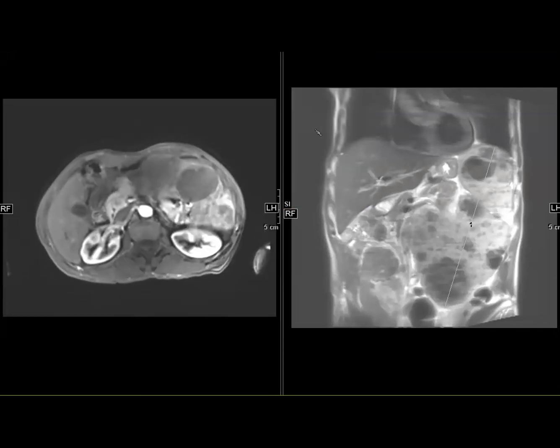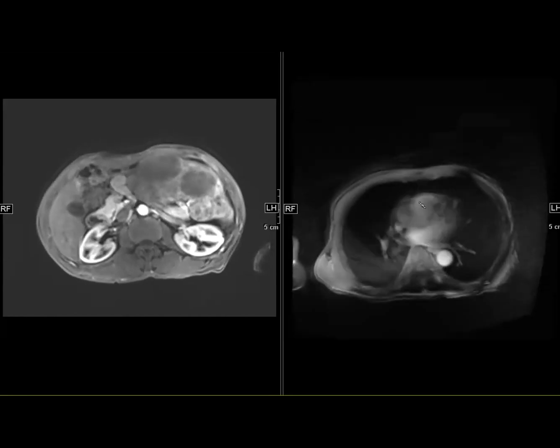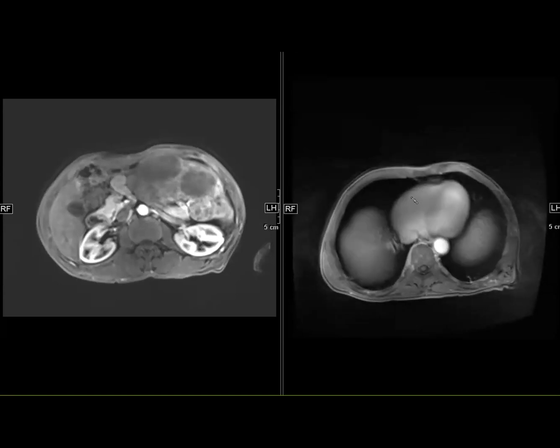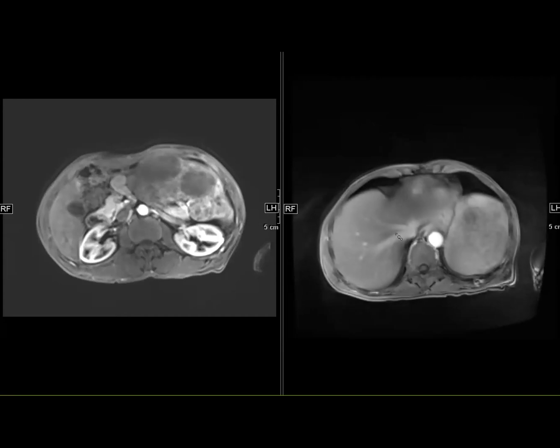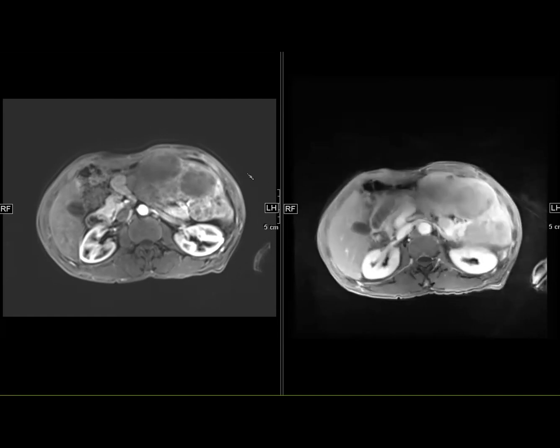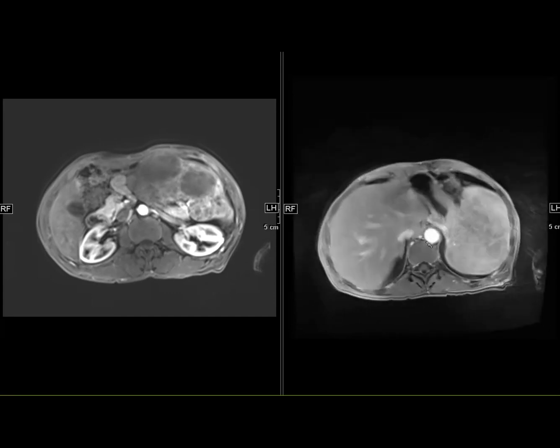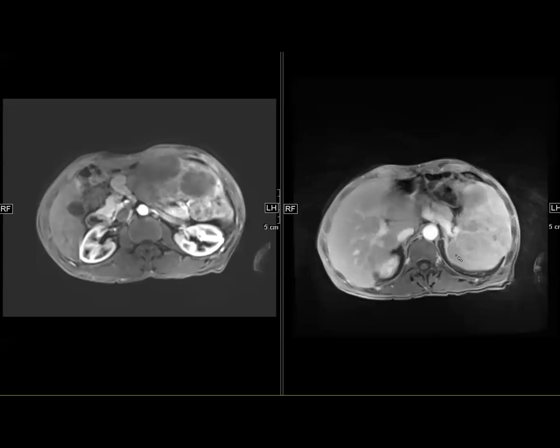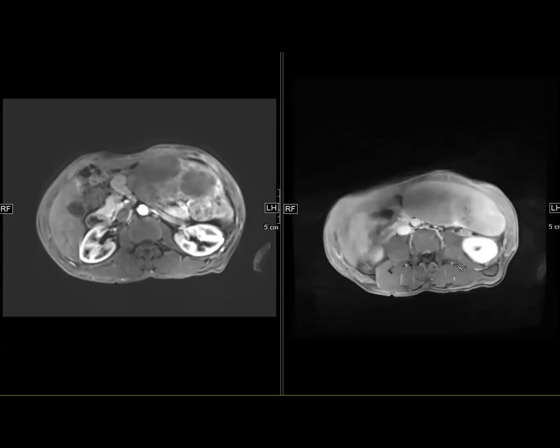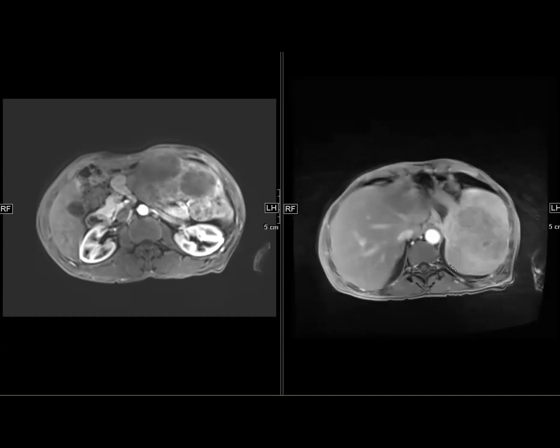Are there any other known underlying medical conditions? No, they were not known before this. I'll tell you some supplementary material afterwards, but in retrospect, I don't think we could have put this together at all. You can see the masses have delayed enhancement. And some relevant labs in retrospect are that the patient is anemic and has a low platelet count. I think we had a case similar to this that turned out to be extramedullary hematopoiesis, but I'm not sure if they looked like this or not.